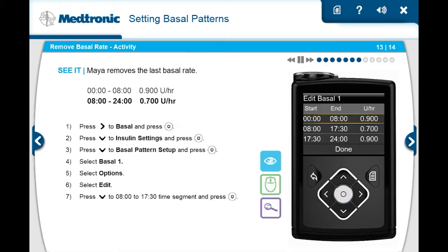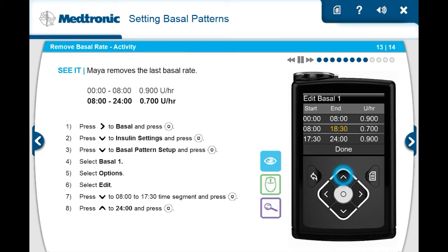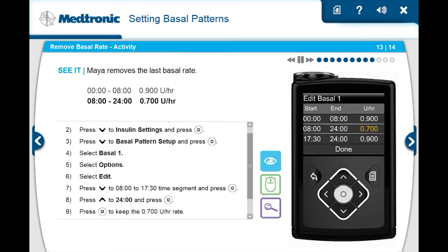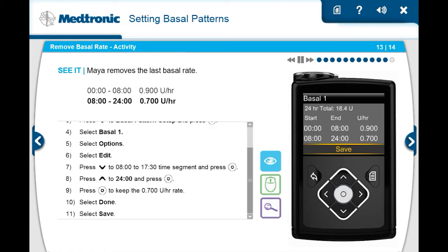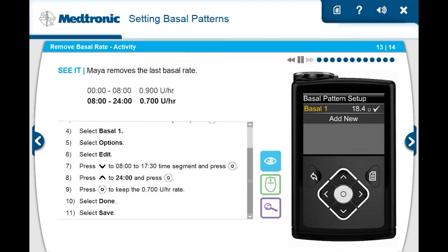She presses down to the 8 a.m. to 5:30 p.m. time segment and presses select. She then presses up to change the end time to 12 a.m., completing the 24-hour programming, and then presses select. No change is required of the units per hour so she presses select. She notices there is no longer a third time segment since she changed the end time to 12 a.m., and then selects done. She verifies the basal rates are correct and selects save. Maya's done removing a basal rate.